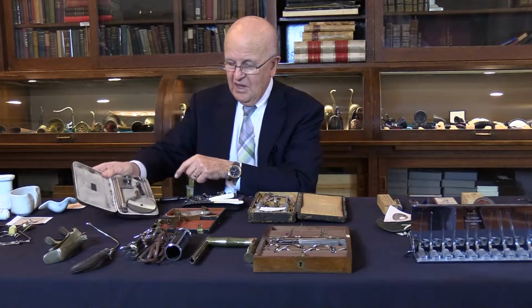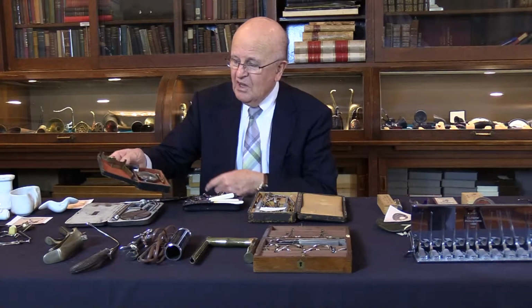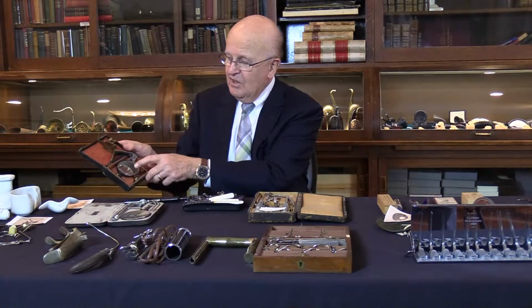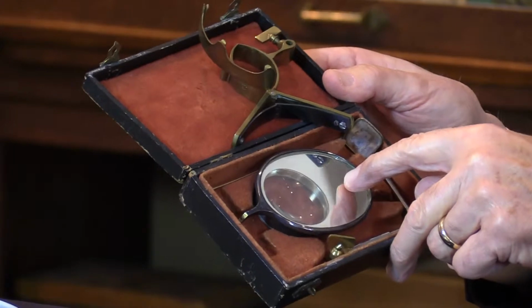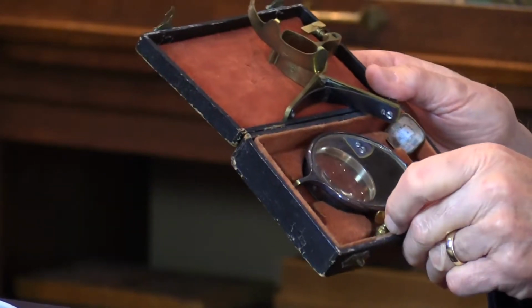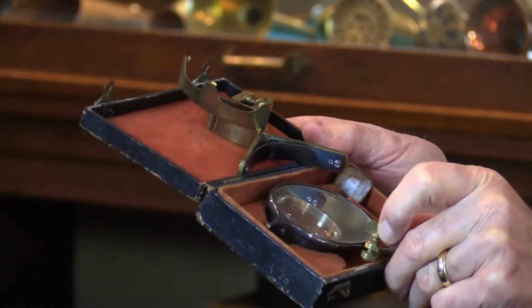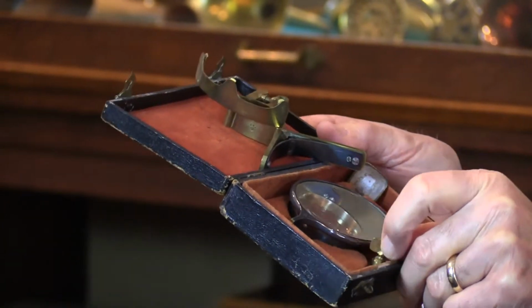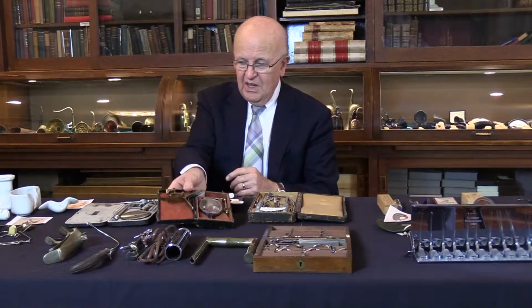examination here. This is a similar device where it has a magnifying glass here, and that's where the light is reflected. It's a complicated one. Again, the same principle. You just stabilize this by fastening this to a steady, stable area and do the examination.